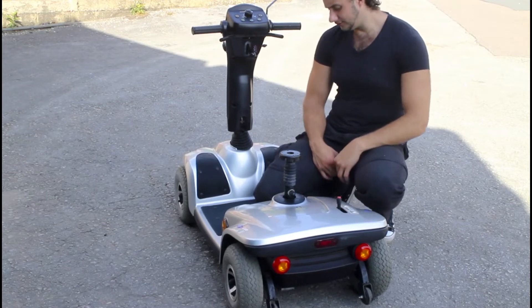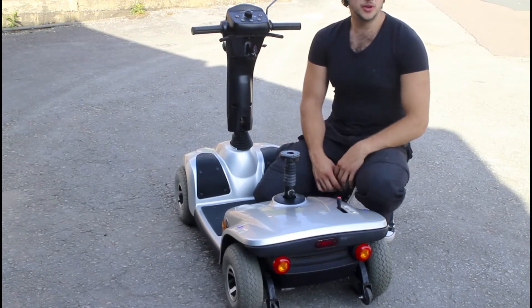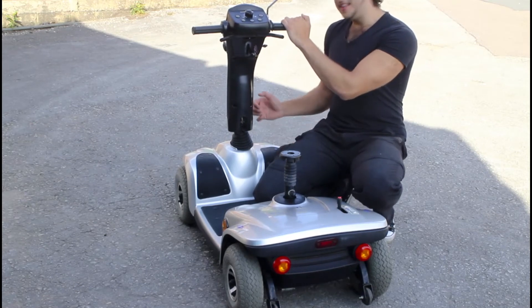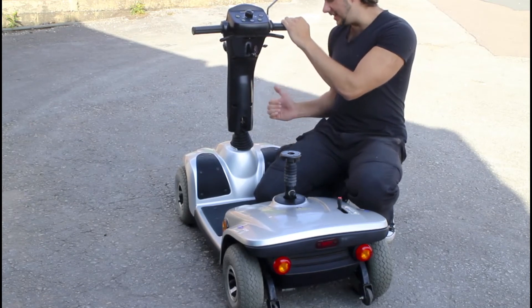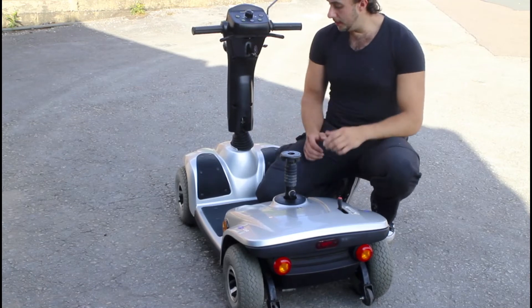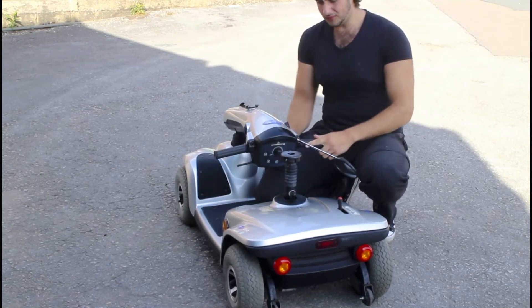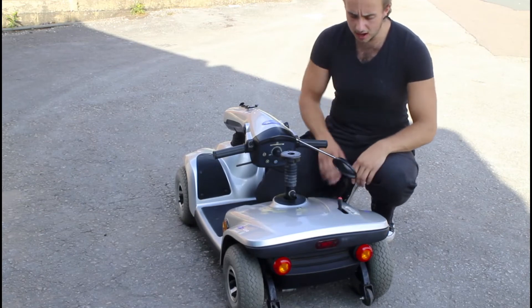On the Pride folding models there's also a lever at the side — you pull that lever out and drop it. Besides that, this is ideal if you just want to drop the handlebars and put it into the car.